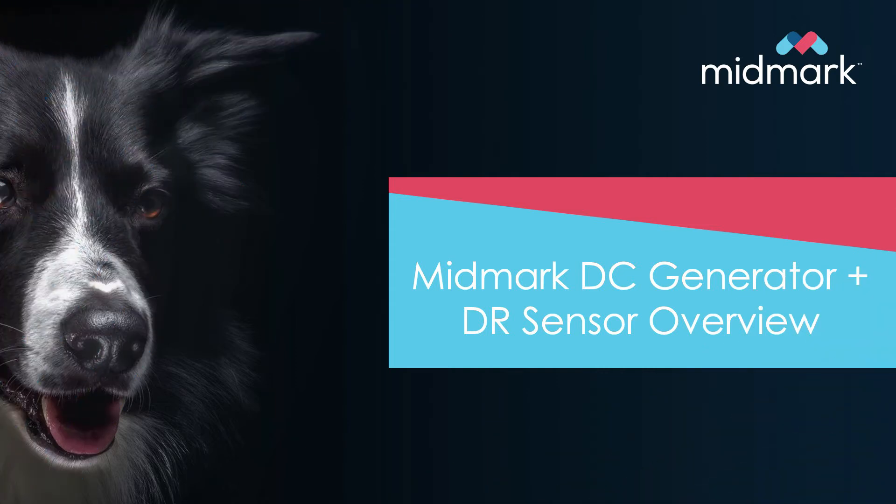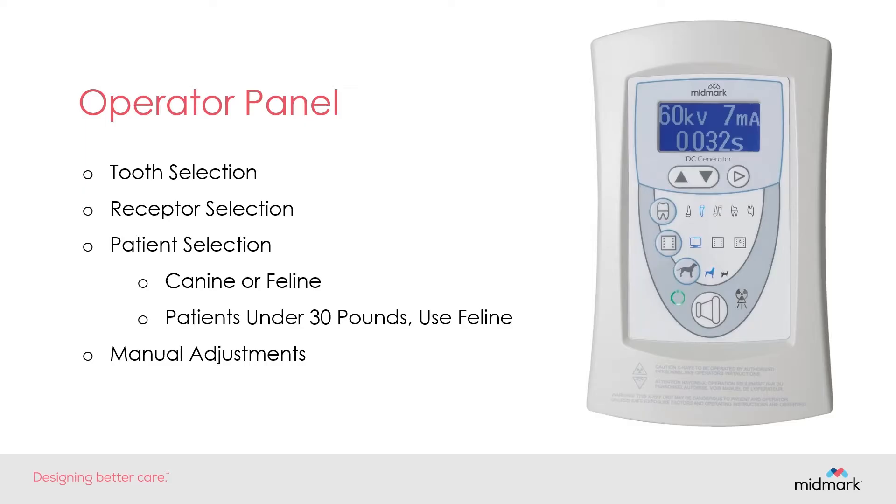Hi, and welcome to the MIDMARK DC Generator and DR Sensor Overview. First, we will take a look at the operator panel.